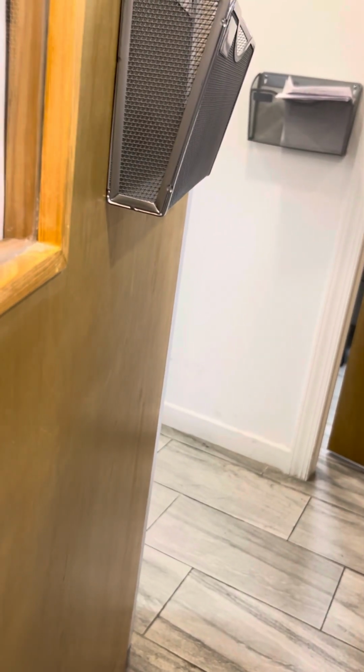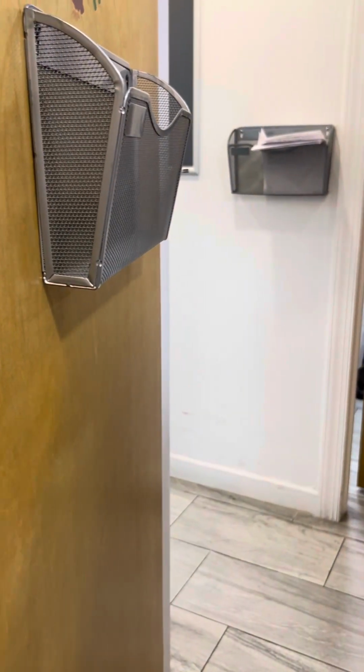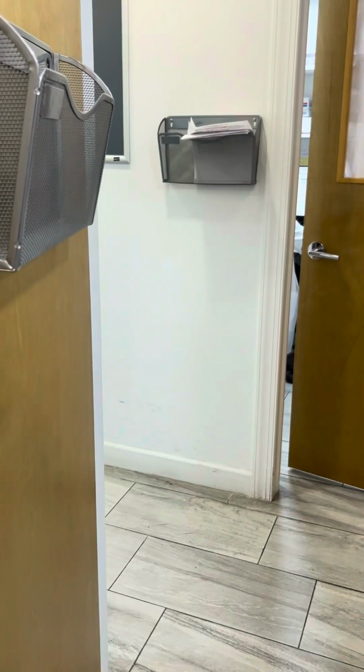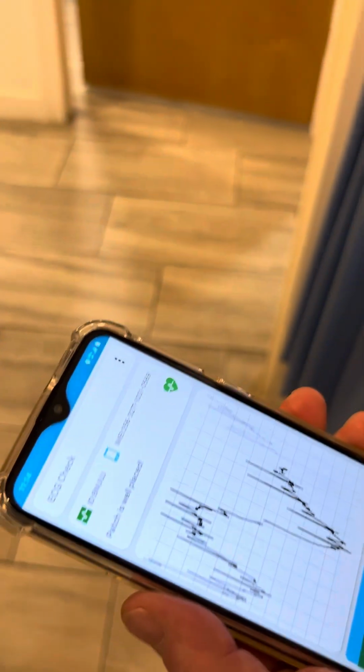So I want you to hold it. I want you to hold those 4 electrodes. So those 4 things right there, that's what I want you to hold for 2 minutes. As you're doing that, you're going to see the EKG start to come across the screen, okay?